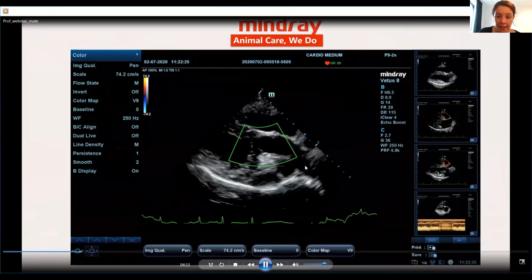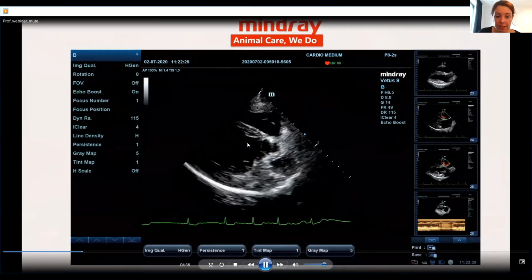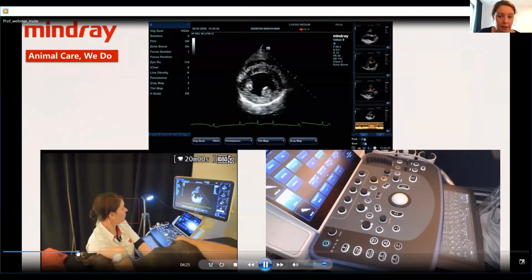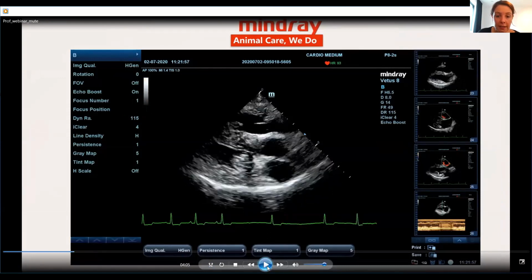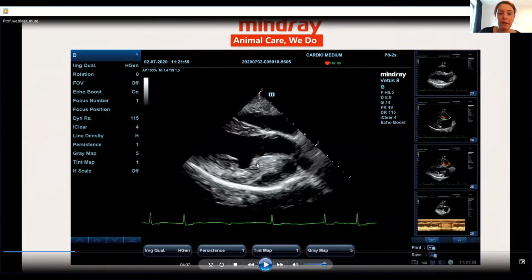Now we're on to the 5-chamber view. So we see the aorta here in the middle. This is the aortic valve. You see, our little doggy is moving. I will go back briefly so I can show you again. So this is the left ventricle. Here we have the aortic valve, and here we have the aortic arch, a little part of the left atrium here, and then a part of the right atrium and the right ventricle here.